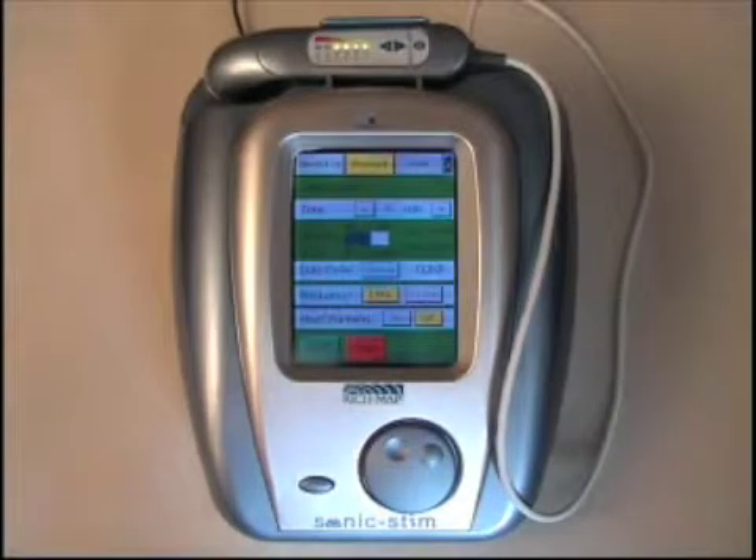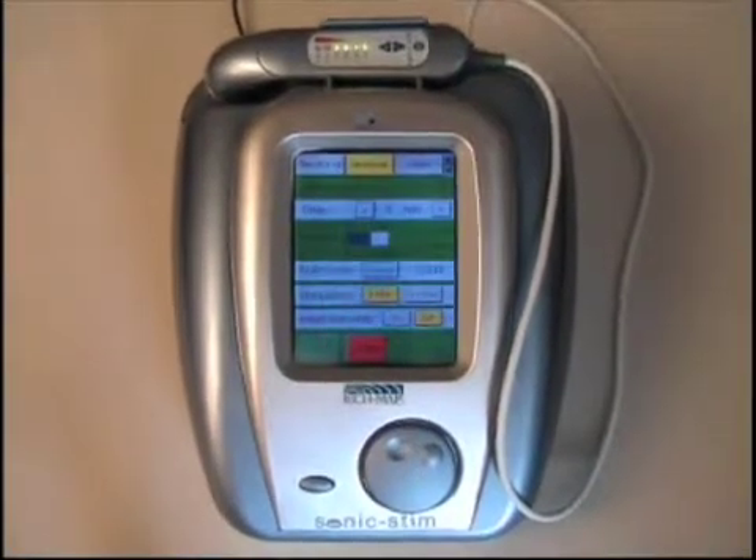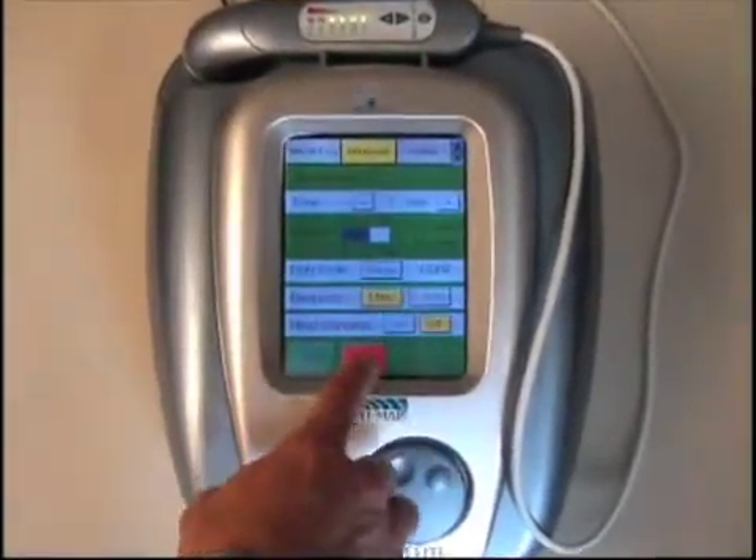Once the treatment is complete, the unit will either time out or you can hit stop at any given time. That concludes the ultrasound.